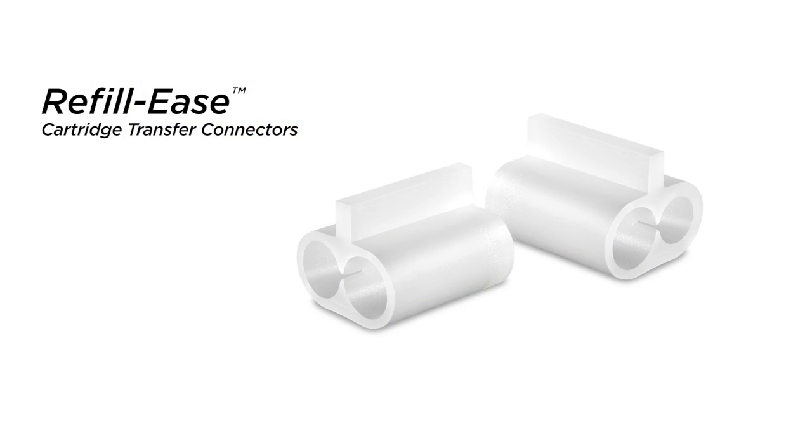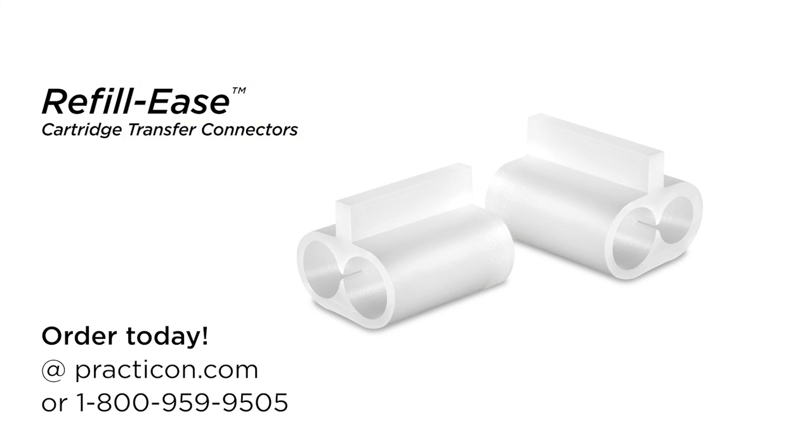Disposable cartridge connectors that reduce material waste and cost by up to 33%. That's Refill Ease, another practical innovation from Practicon.